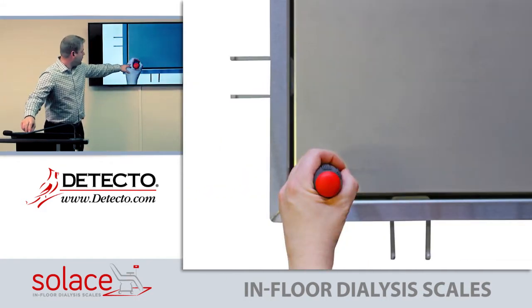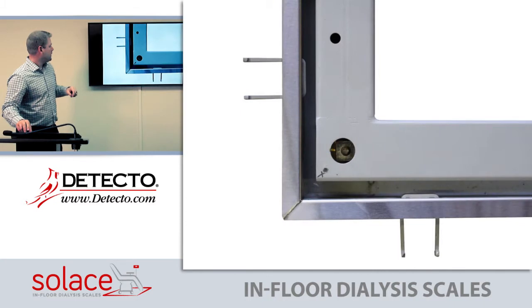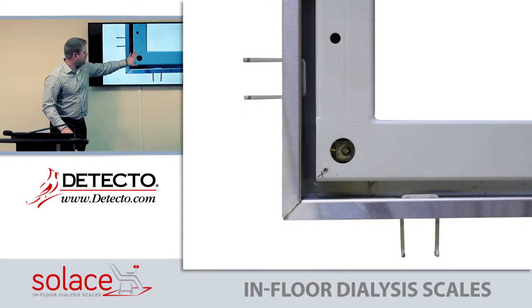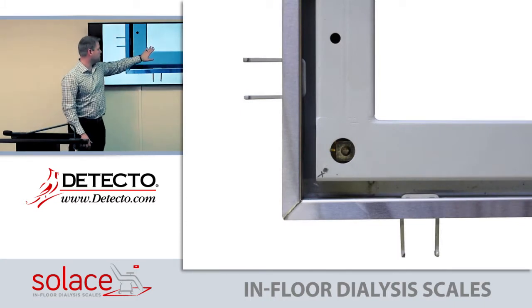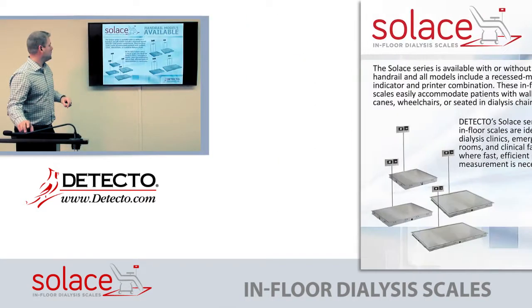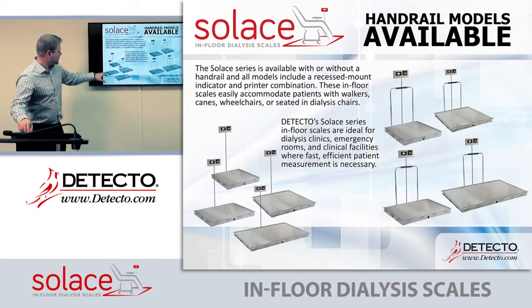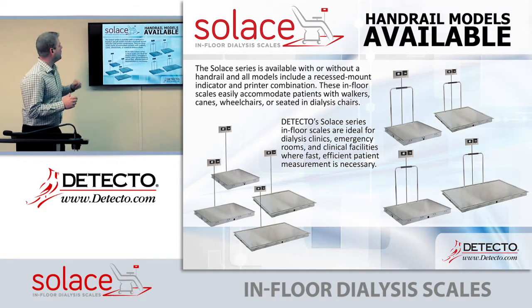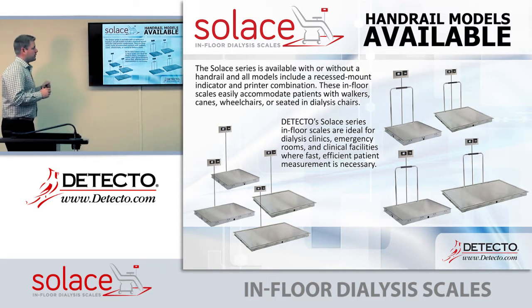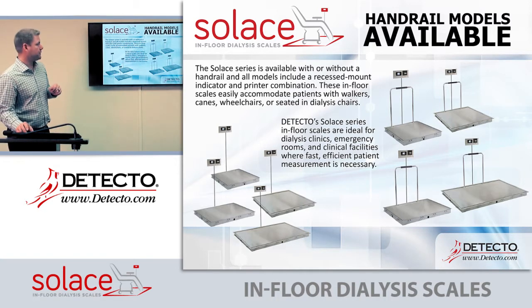You can see here how you would remove the deck. Here's a close-up of the deck — very clean and nice. Here it is with the deck removed, showing the understructure where your concrete would be. Here are some of the different models, some with handles, some without. They're very easy to maintain, and the entire scale is built for the sole purpose of dialysis centers.